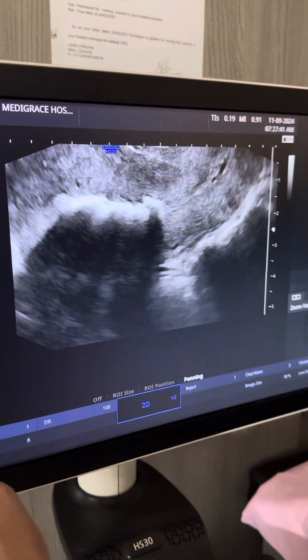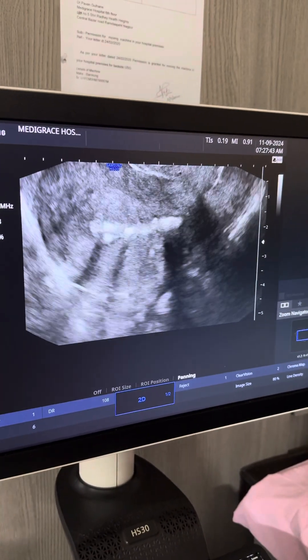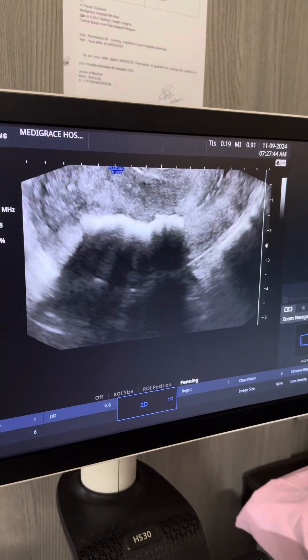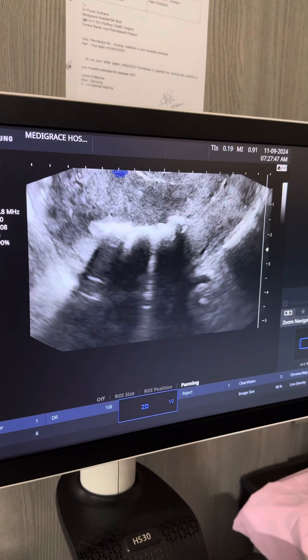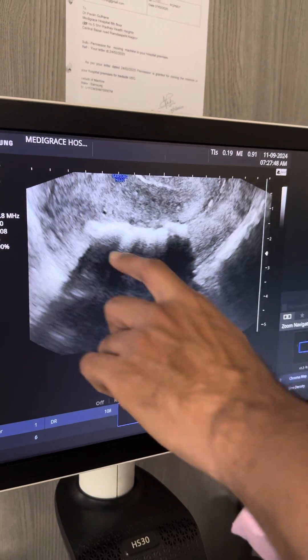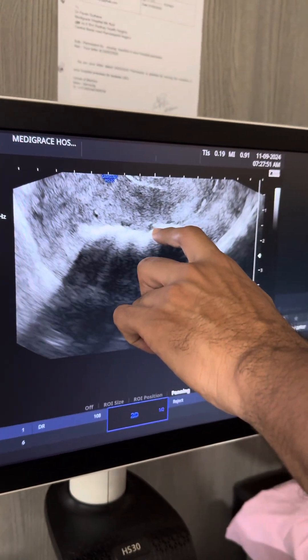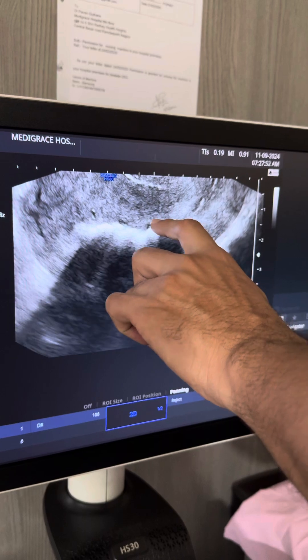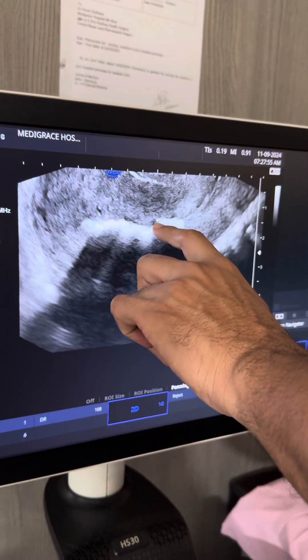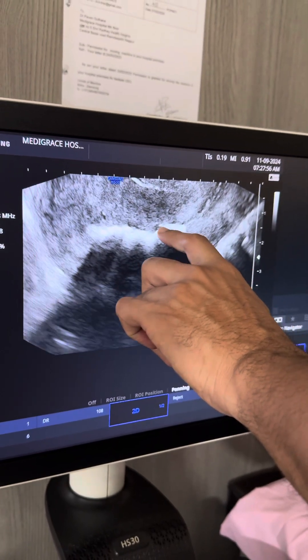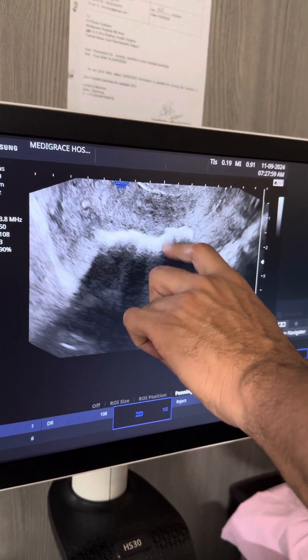This is a case of osseous metaplasia of the endometrium. You can see on the ultrasound picture all the bone shadows here — irregular. You can see the edges of the bone, going from one direction, and because they are stiff they are forming this kind of angle.